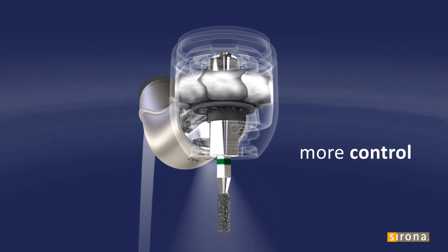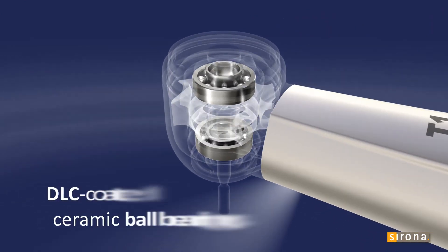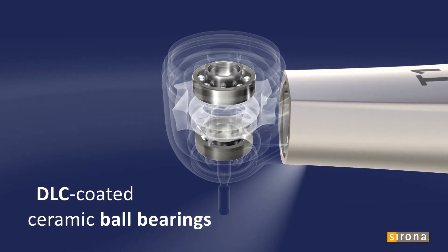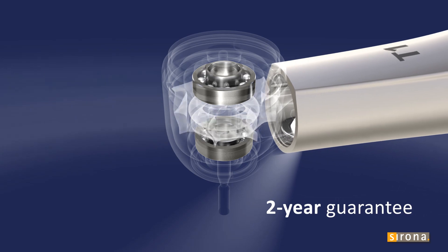More control, more comfort, longer service life. The diamond-like carbon coating of the ball bearings makes the T1 turbine extremely resilient and durable. Your investment is secured by our two-year guarantee.